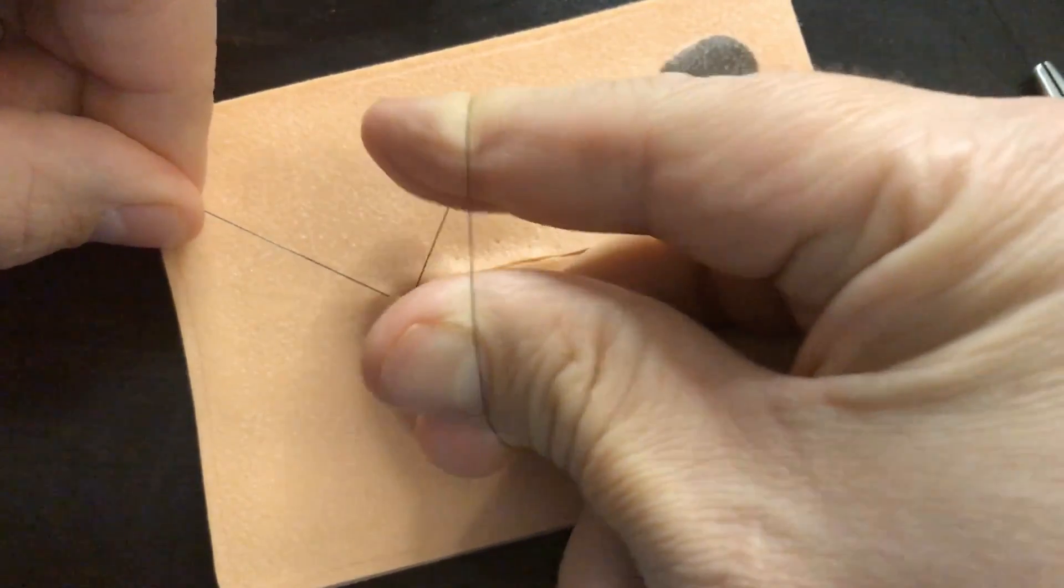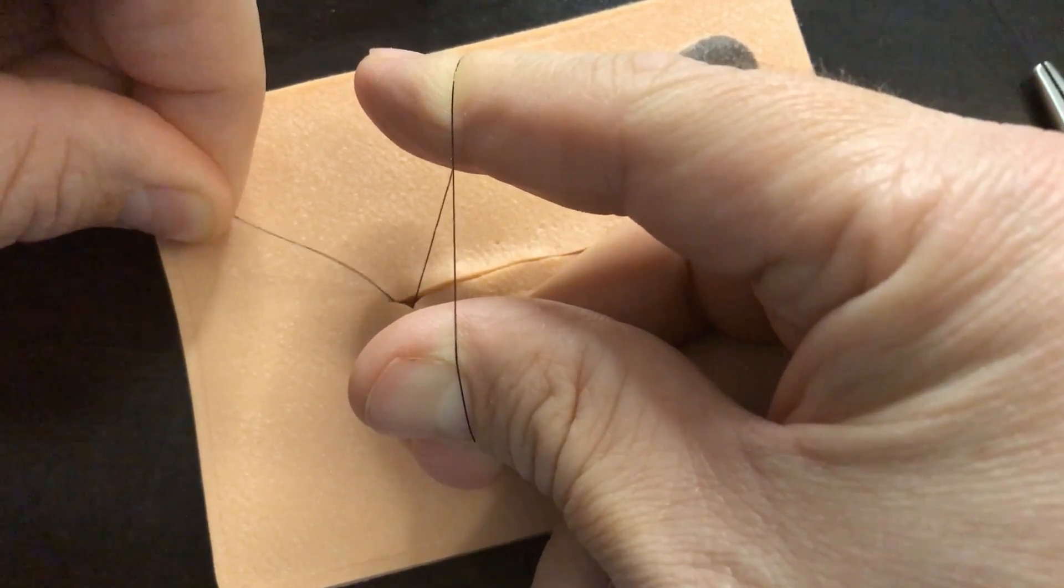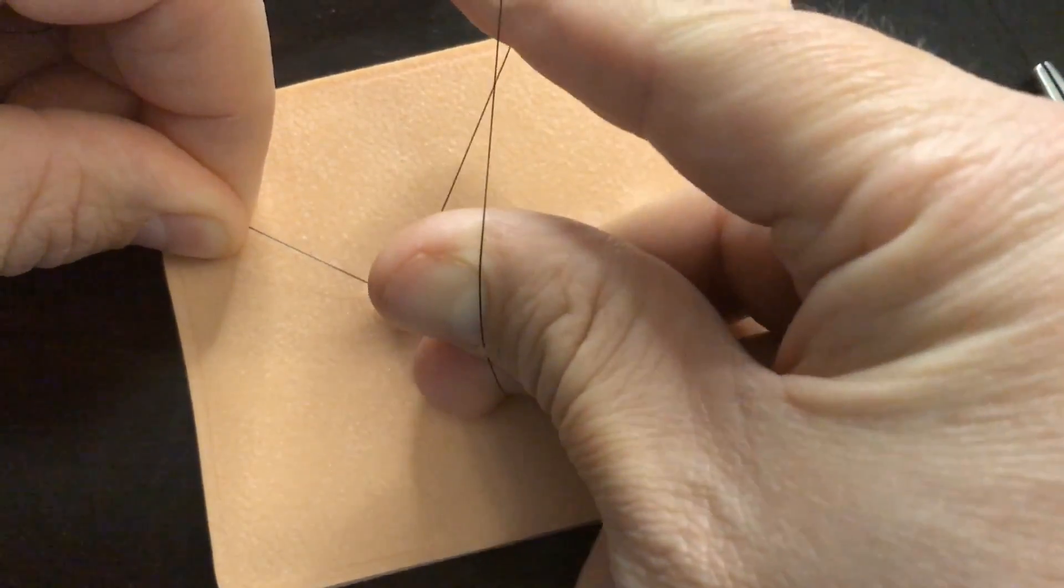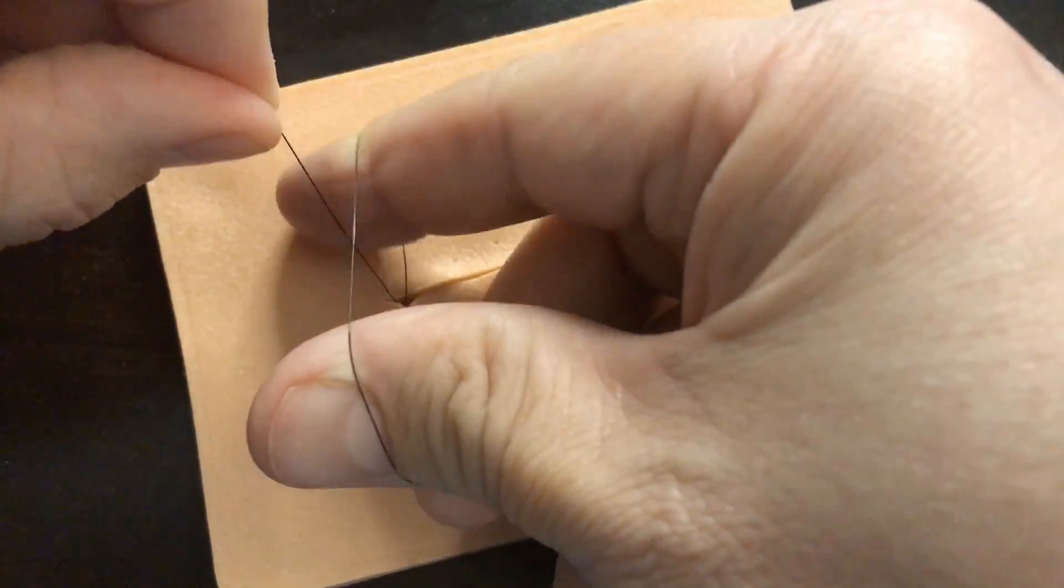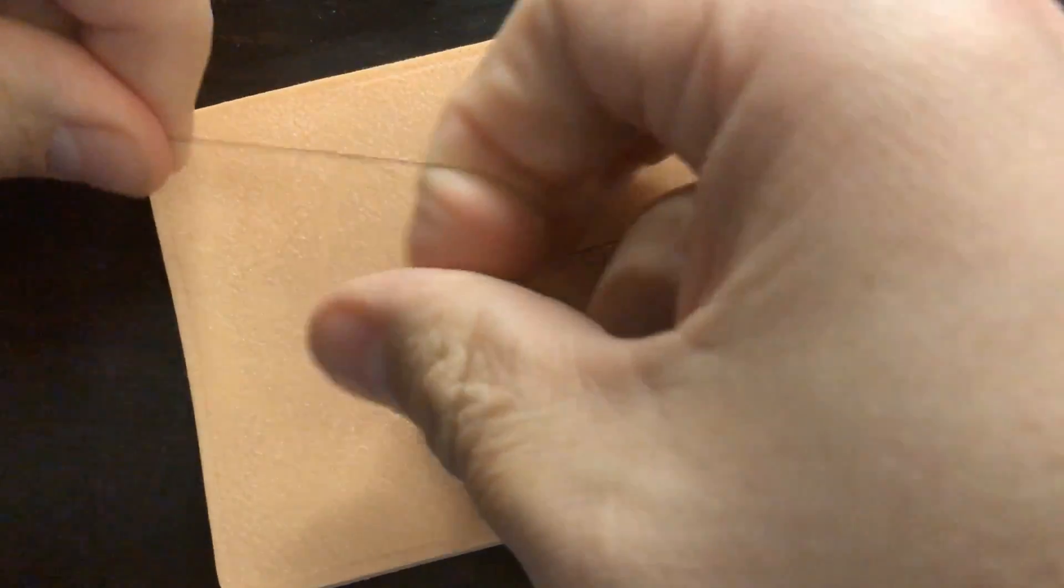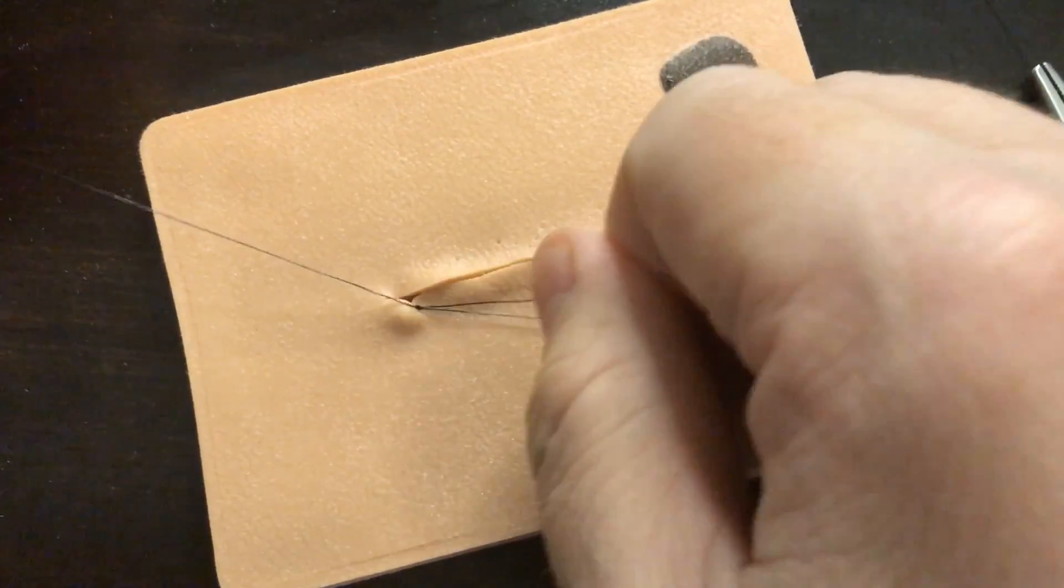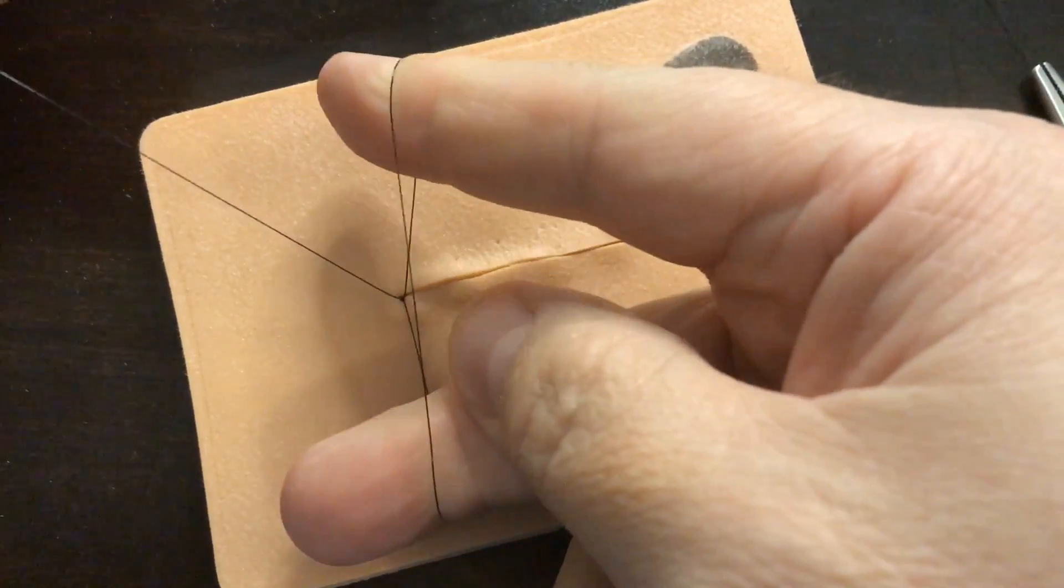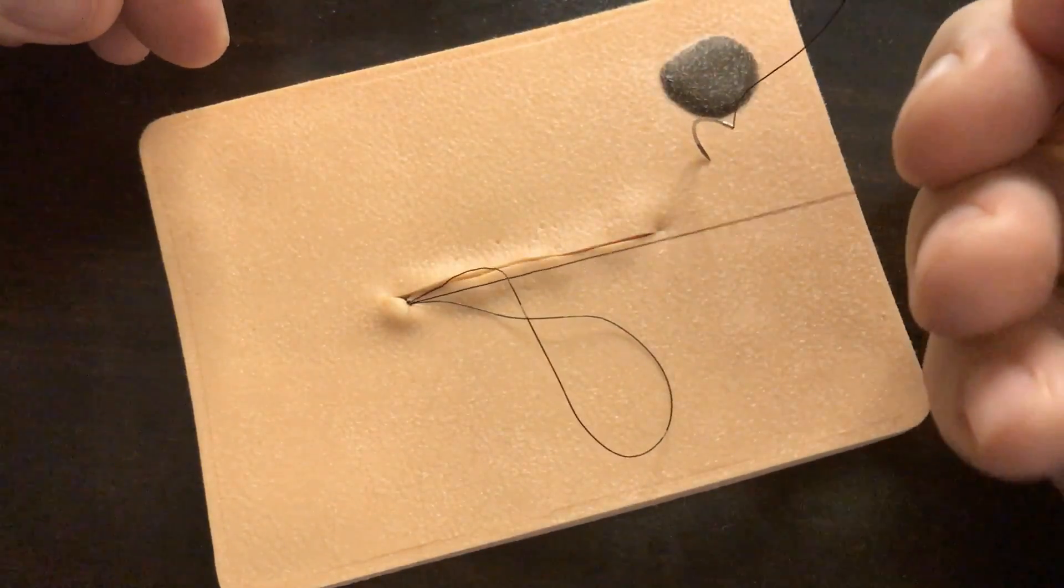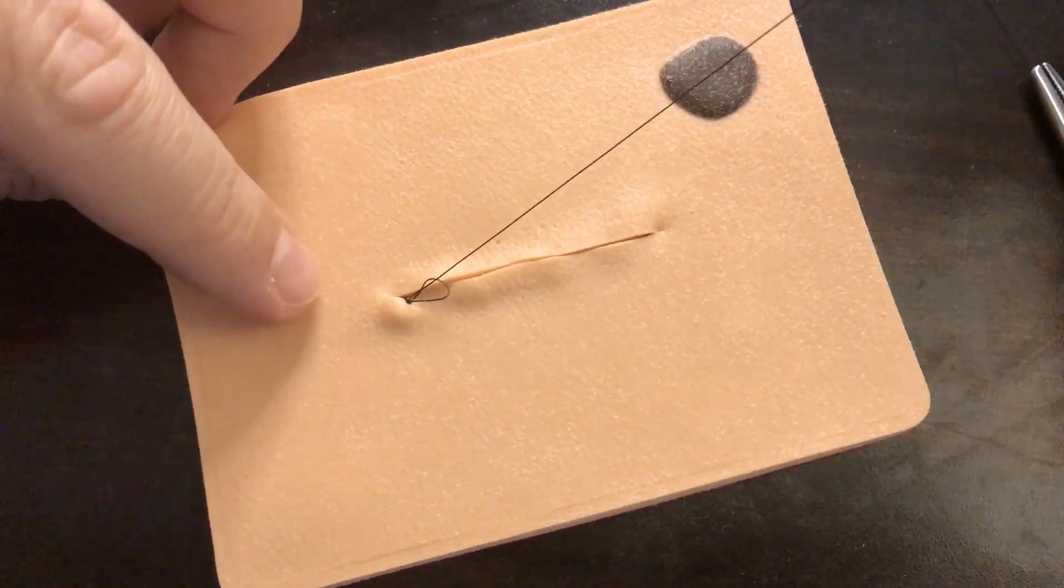So I'm pulling that. I'm holding it tight with my left finger, with my left hand here, holding tension, pulling and tightening that by kind of wiggling back and forth here with my loop. And I'm going to do that a few times, at least four, maybe five times. And that's tightening that knot down. Now for the last move through this, I'm going to pull it through now. So did you see that? I pulled it through my loop and I'm going to now pull the loop tight.